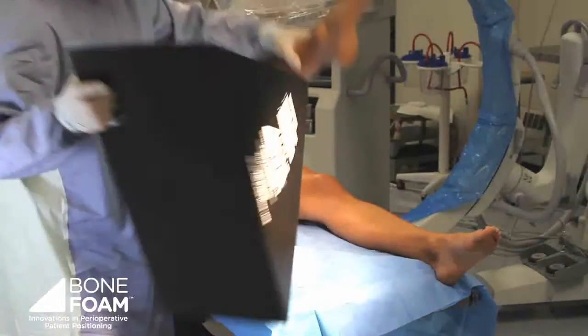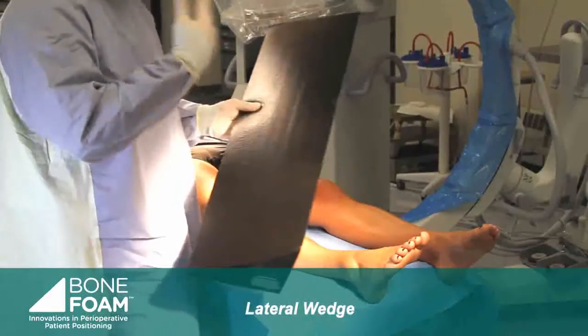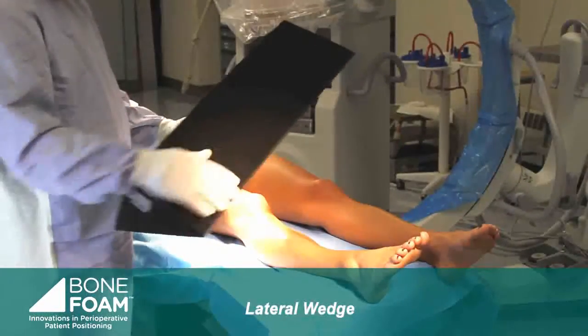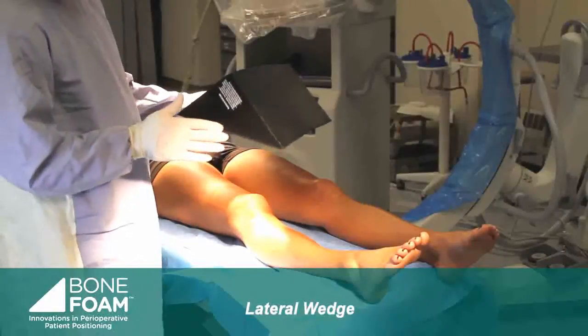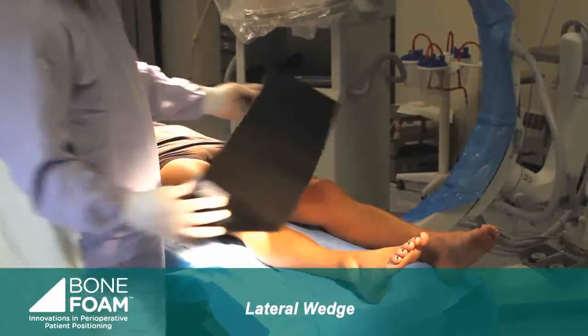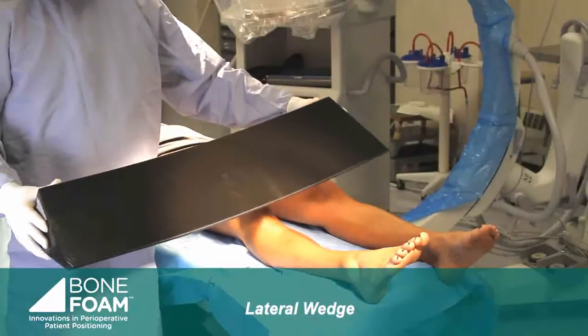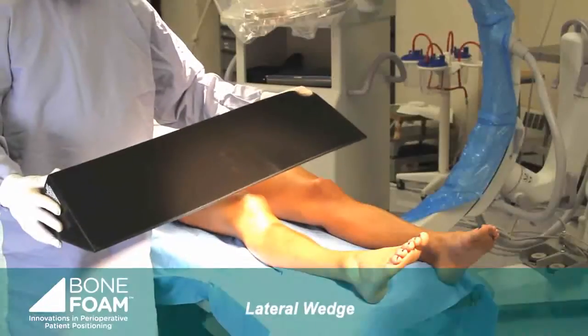Now, in the case of a retrograde femoral nailing procedure, one would typically, with a freehand approach, want the patient tipped up approximately 25 degrees. So this is a body wedge which really fits underneath the thorax and the buttock to tip the entire patient up during the procedure. The lateral wedge tips up underneath the thorax and buttock to be able to do that.